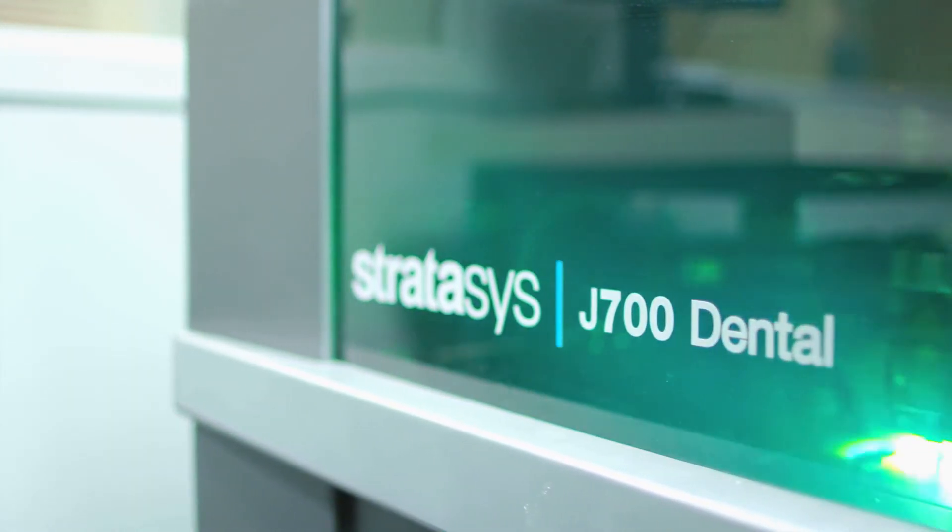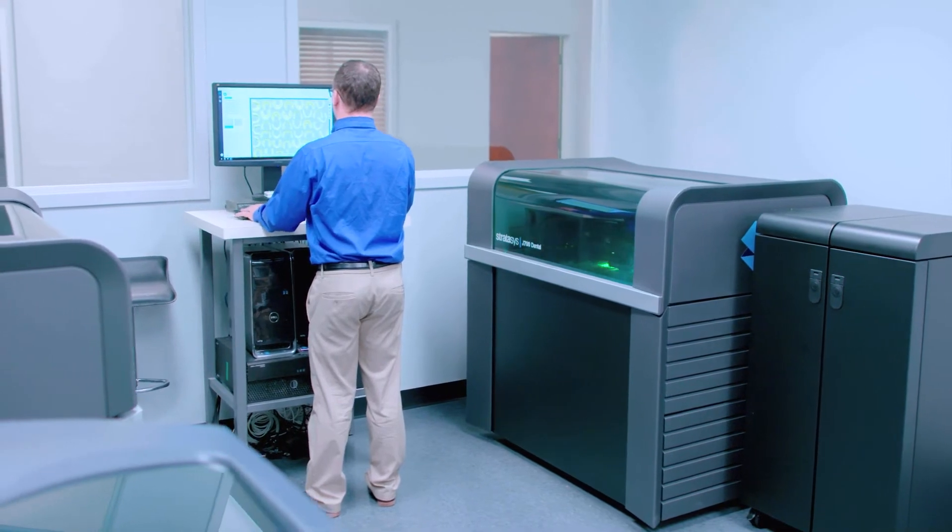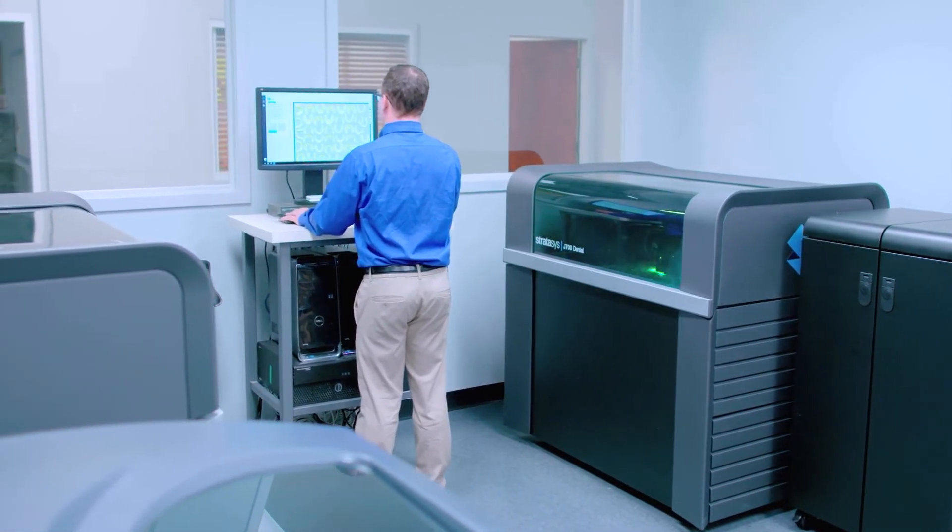The implementation of the J700 into our orthodontic lab was seamless. We went through the beta program with Stratasys with no hiccups at all. A very important part of buying a 3D printer is recognizing all the other factors that go in besides the printing, and for us Stratasys provided a platform that allowed us to post process faster than other printers we have tried.